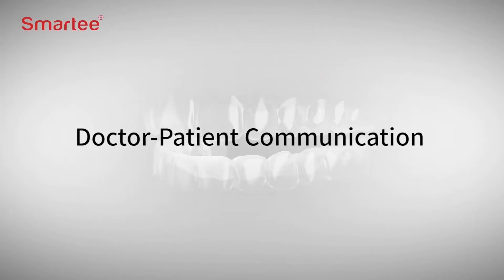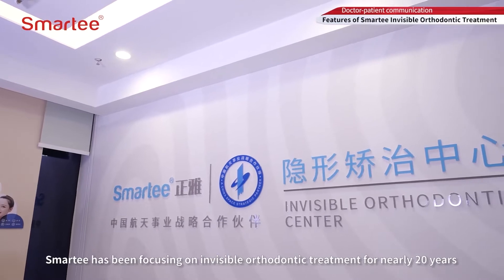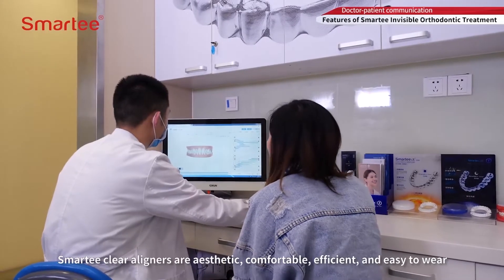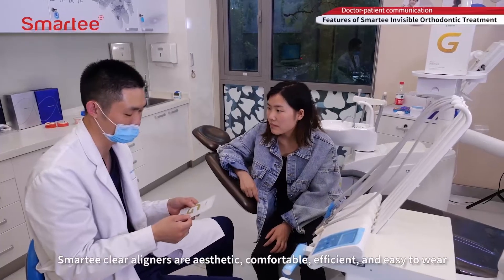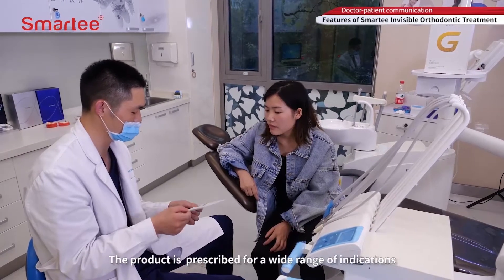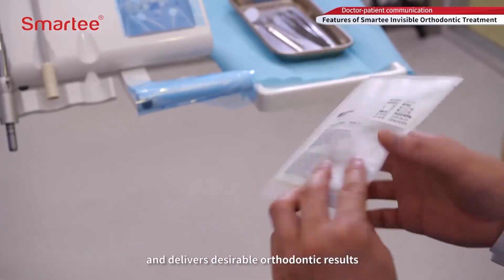Smartee has been focusing on invisible orthodontic treatment for nearly 20 years. Smartee Clear Aligners are aesthetic, comfortable, efficient, and easy to wear. The product is prescribed for a wide range of indications and delivers desirable orthodontic results.